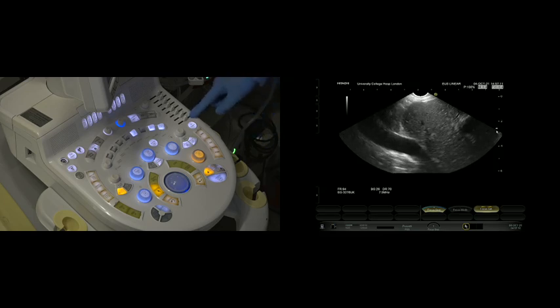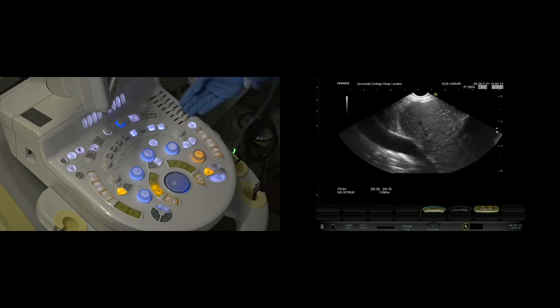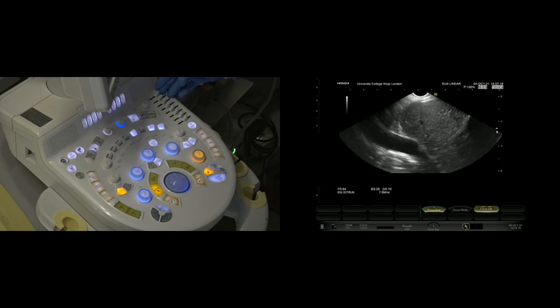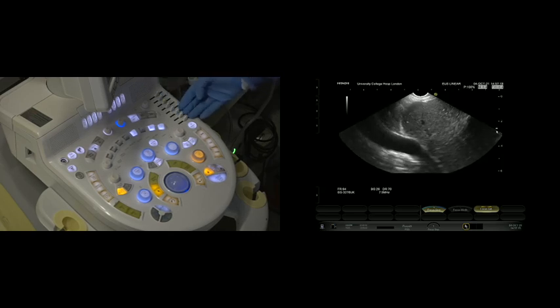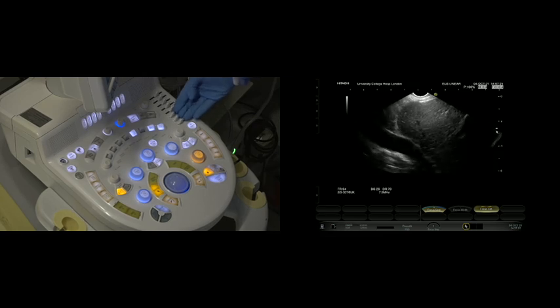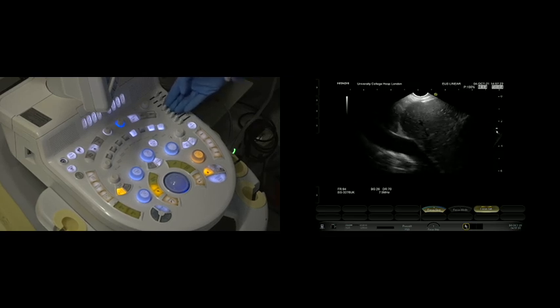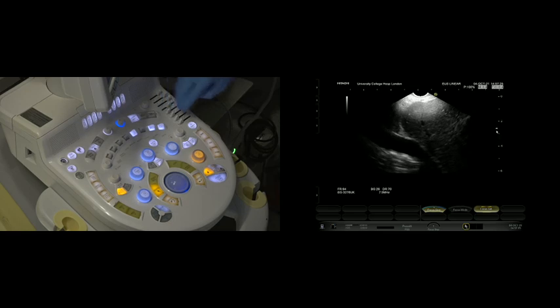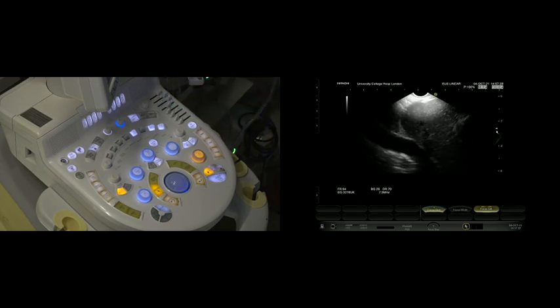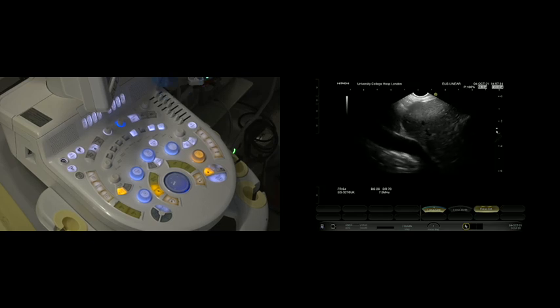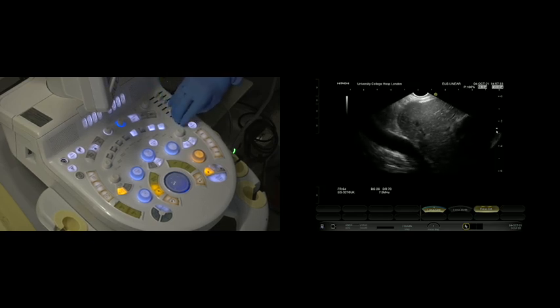The other thing that you might see go wrong is the gain at different sites of the image. These sliders, a bit like a disc jockey's desk on Radio One, you can drop the gain lower down and bring them up higher up, and then you get a very perverted image. So for a neutral diagnostic scan, you want those to be in the middle.